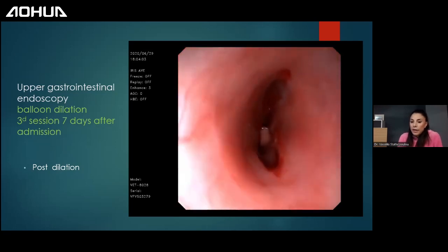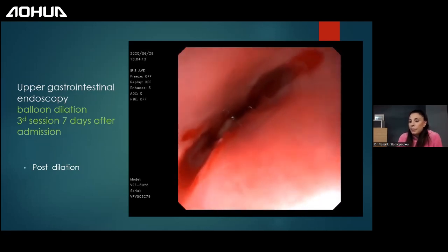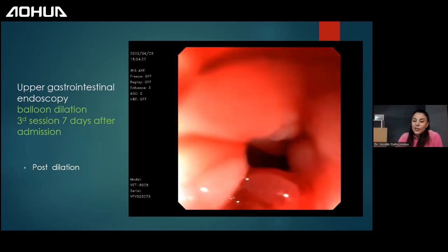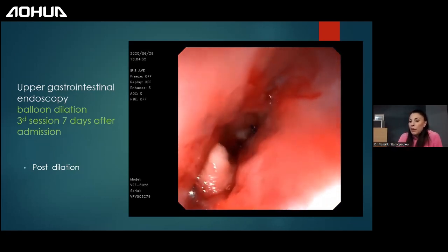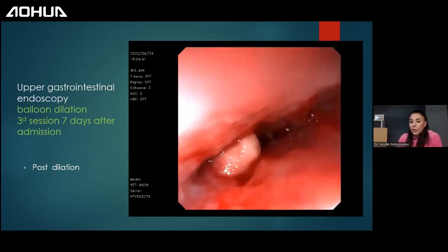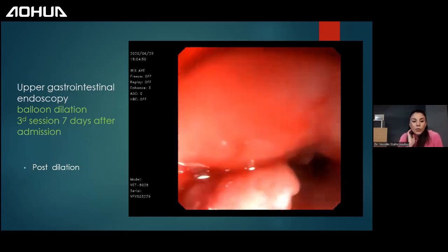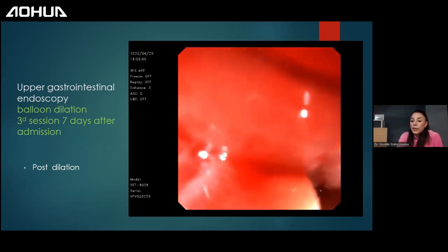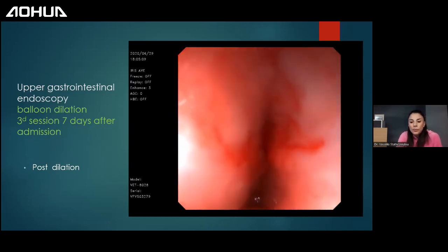And of course, after every procedure, we give sucralfate and an antibiotic. It would be great if most of them, for example the antibiotics, you could give as injections. But in cats, it's problematic because we will have the feline injection-site sarcomas with the injections. But anyway, in these cases, I try to give the antibiotics in injection form, since the fewer pills they take by mouth, the better. The sucralfate should be in suspension, not in pill form, because pills don't coat the esophageal mucosa. Okay, so we cause the trauma again. And it took these 3 dilations, actually, for this cat to have a circumference that's good enough to eat canned food, for example. The owners were happy with that, so that was great.